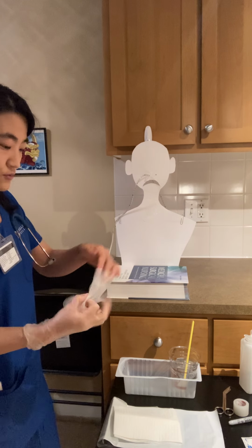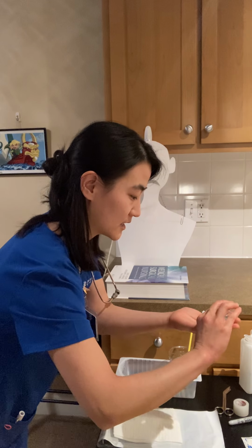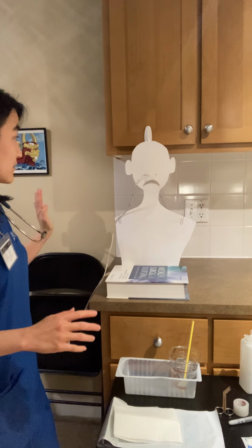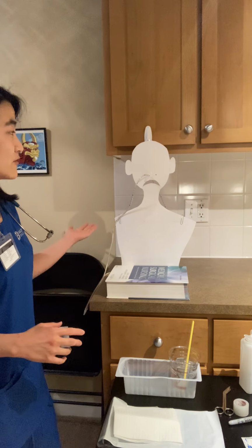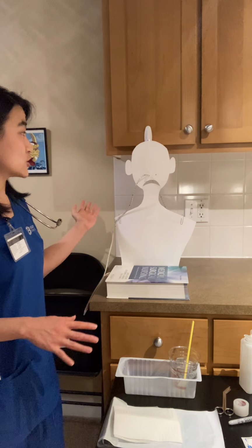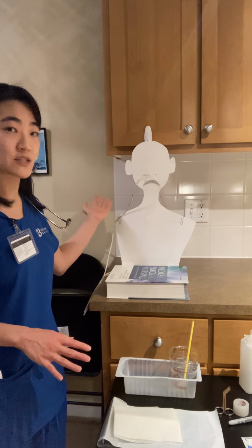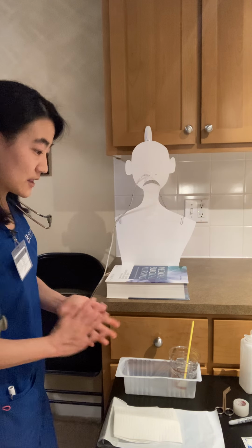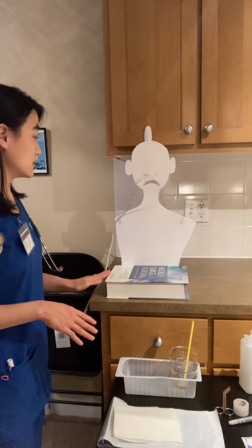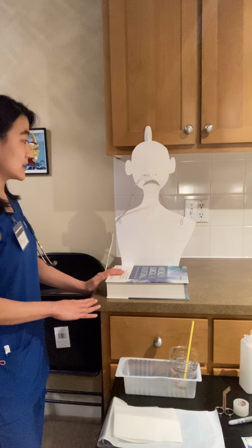And then I'm going to remove my gloves for my hand hygiene. And then if the patient wishes it, I'm going to lower the head of the bed. However, I am going to make sure that the head of the bed still stays above 30 degrees to decrease risk of aspiration. And then I'm just going to make sure that the patient is comfortable. All right, Mr. Nguyen, you're all set. Here's your call light. Let us know if you need anything.